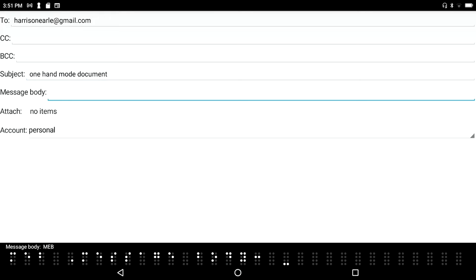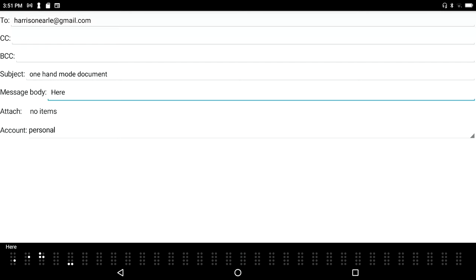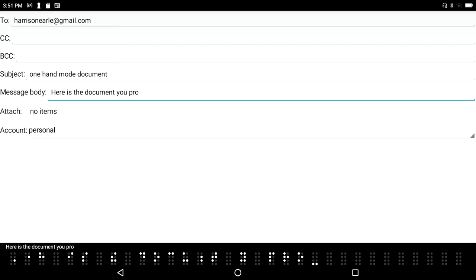Message body, multi-line edit box. I can just type in here - 'Here is the document you promised yourself.' I know I need to get out more, right?